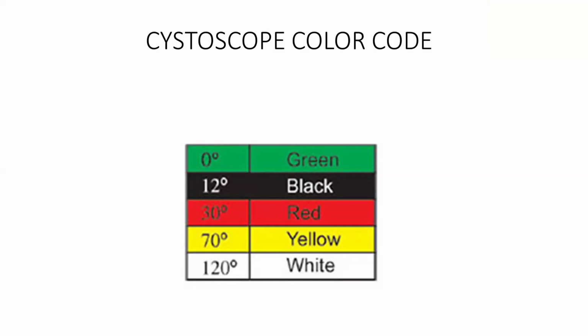Yeah, what you are saying is right. The only thing is the new one I know is 60 degrees, means 0 degree, left hand side 60 degrees, right hand side, above, below, all 60 degrees. So as you are saying very rightly, it is 120, full view becomes 120 degrees. And the older one, I am not sure whether it was 45 or 30. One has to confirm it.